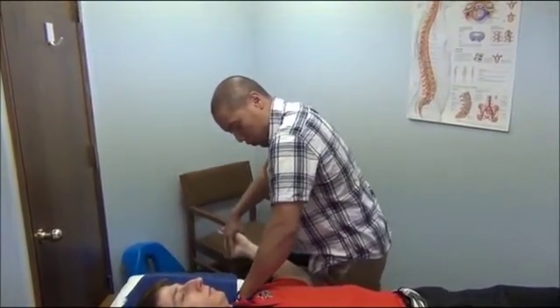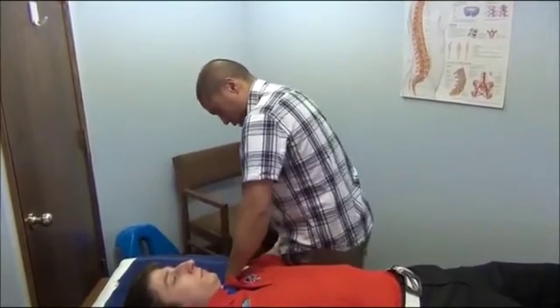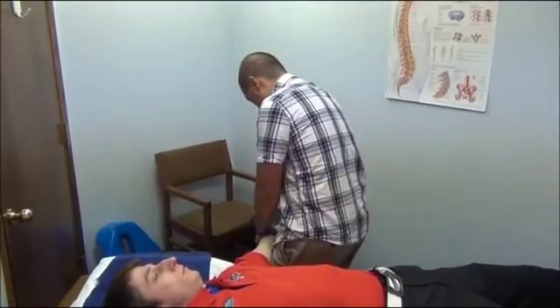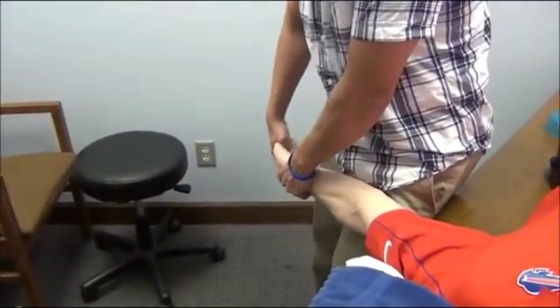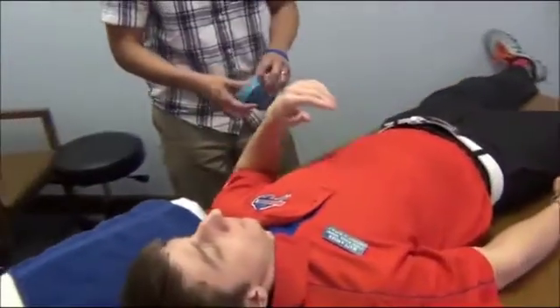So a little shoulder depression, abduction, full external rotation, full elbow extension, full supination, making sure I have his thumb and his fingers, not letting his DIPs bend around my hand, and that's all the wrist extension he has. So I'm going to try wrapping the forearm, see if that makes a difference.